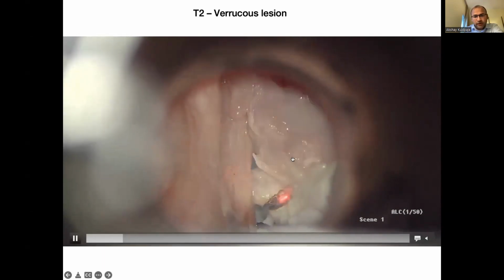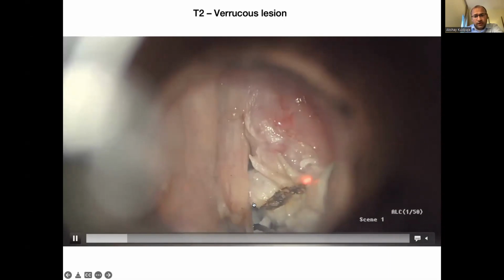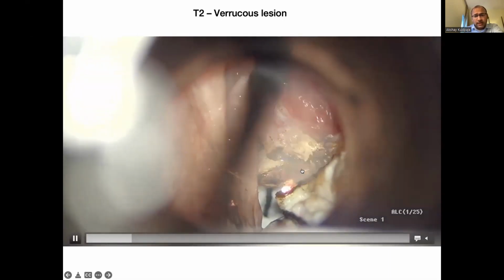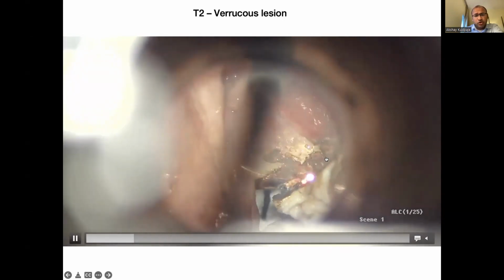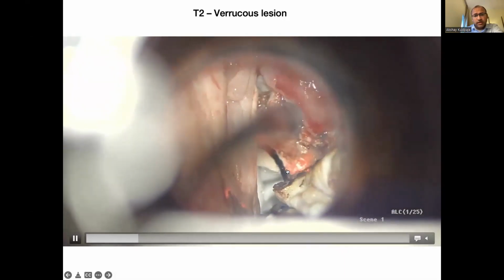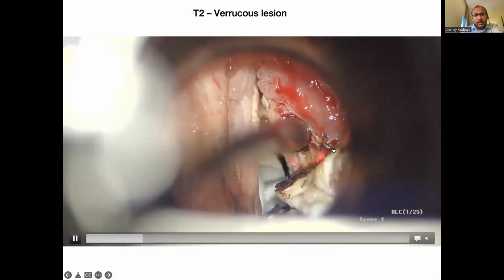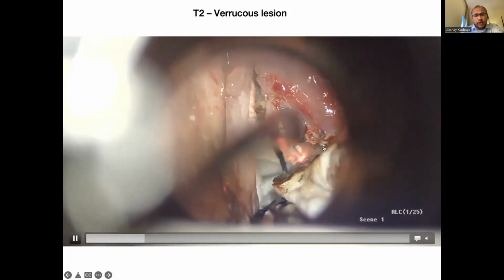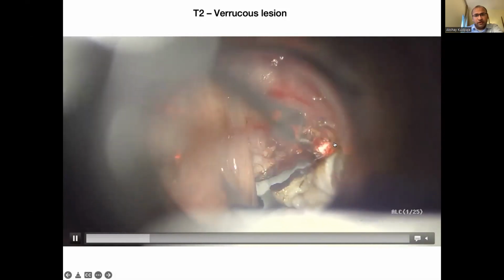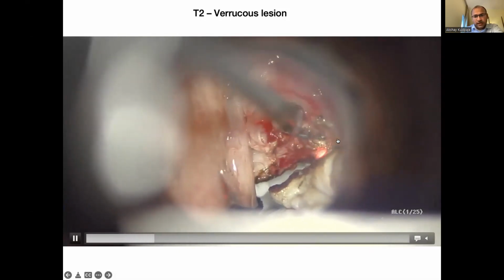So in this kind of extensive resection, it's better to do a transtumoral resection, first using laser to break it into blocks, that is to ascertain the depth of the tumor-free margin. So you can see that when the laser cuts on this tumor region, there is carbonization. However, when you have a carbon-free tissue area, that means you are well away from the tumor. That is further confirmed by a frozen section.